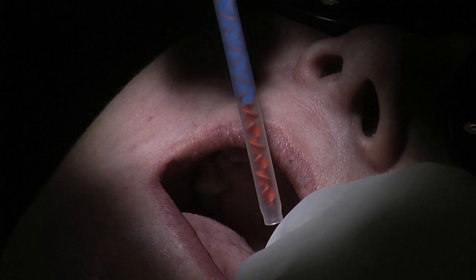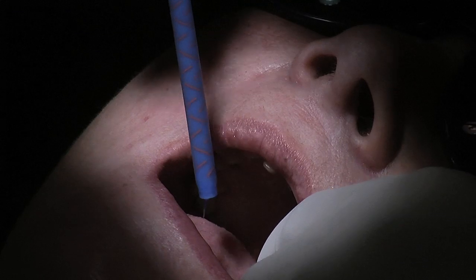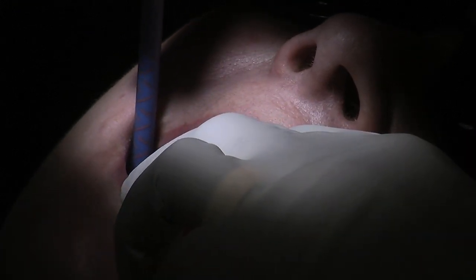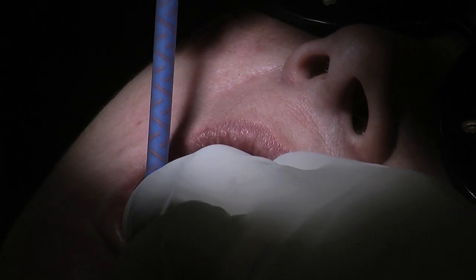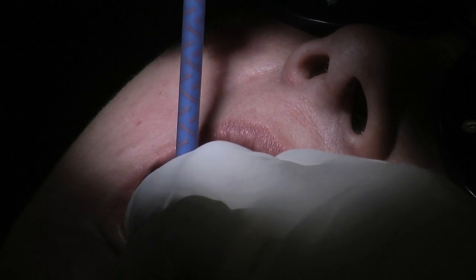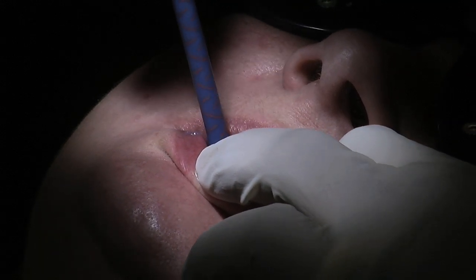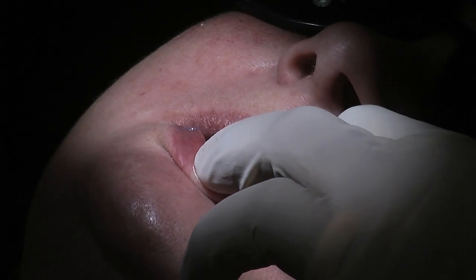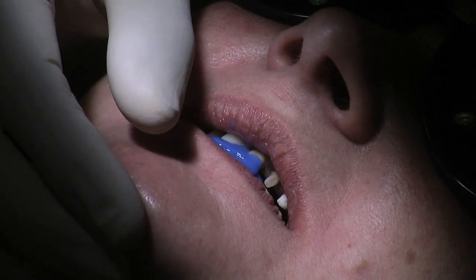Keep open now, Dina. I'll tell you when to bite. So I'm going to syringe some on the molar at the back on the right, then a little bit on the molar on the left, and then just a small amount at the front here. You've got to be very careful of undercuts, because this is very strong material once it's set. Bite together, Dina — good, just keep together. That's very, very good. Just going to syringe a little bit here. So the patient is now biting firmly down. I'll leave it in for about two and a half minutes.